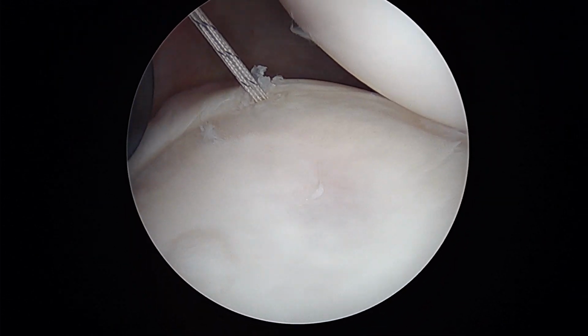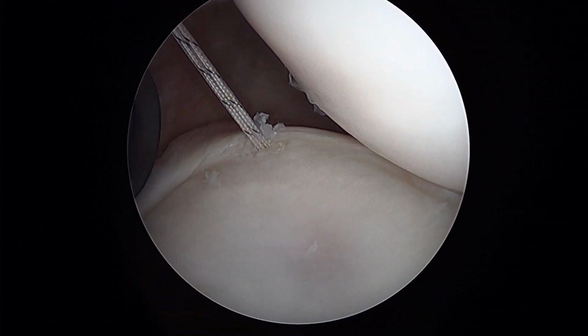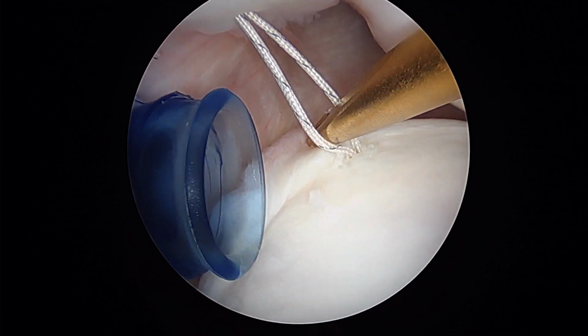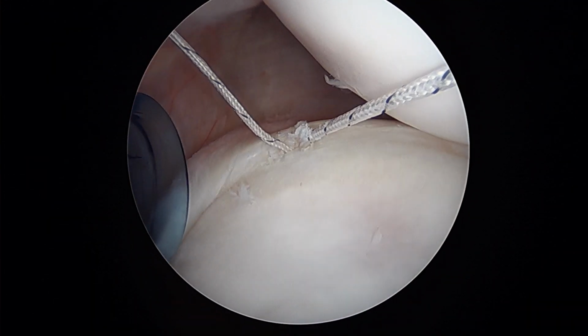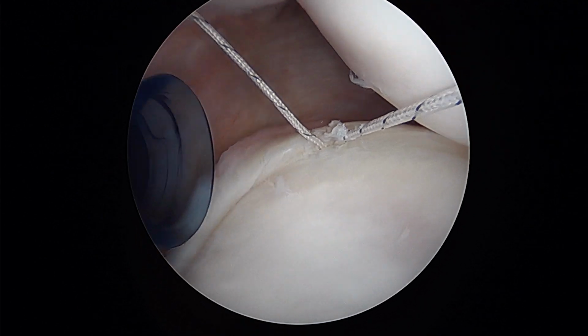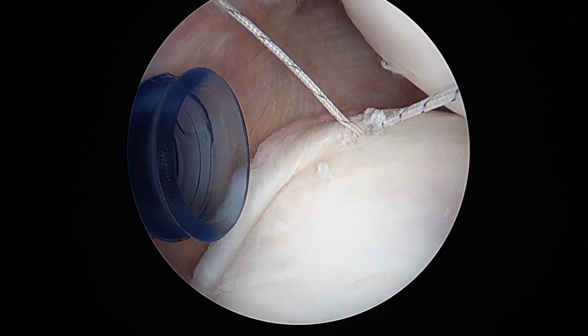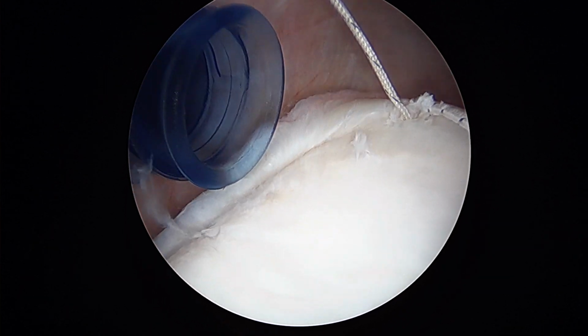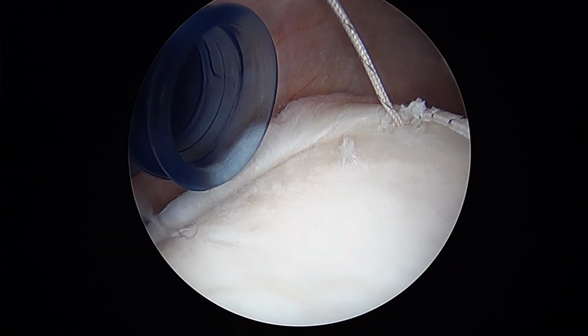So crochet hook to me and a pincher tool to guard. Actually, I can do it just here. So we'll get one of these just like that. Grasper in the front. Turn to the right to me. Go other way.